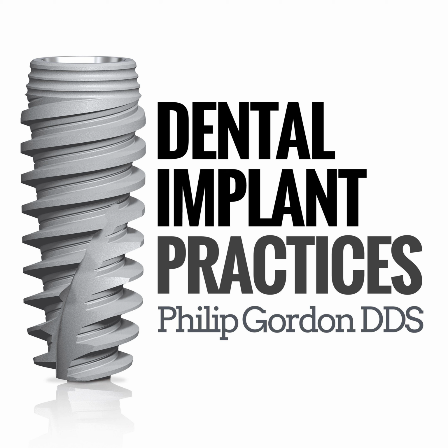And the thing that is a little bit different about guided implant surgery is that when I was trained to do implants 20 years ago, we were taught, you basically look at a two-dimensional panoramic, you examine the patient, you maybe get some study models, you maybe do some type of guide to help you with your implant placement. But essentially you were flapping the area open, looking at the bone, and then placing the implants where the bone was. And as a result, probably 10% of the time, 15% of the time, the implants weren't exactly where you had planned to put them.